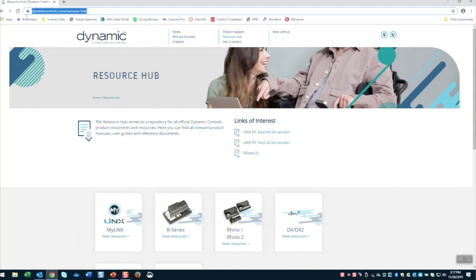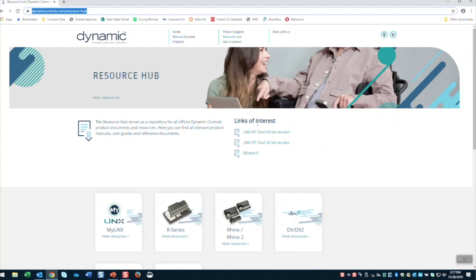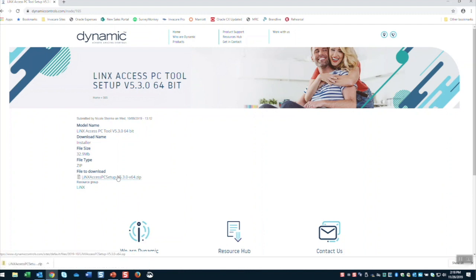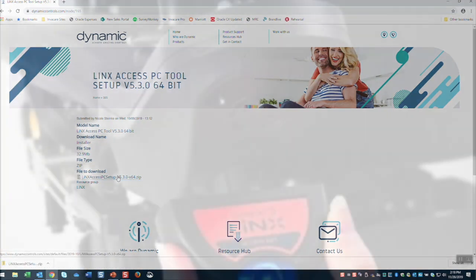Next, you will log in to the Dynamic Controls website at dynamiccontrols.com/resource-hub. In the center of the page, under Lynx of interest, click Lynx PC Tool 32 or 64-bit version, depending on which operating system you are running. Then, under File to Download, click Lynx Access PC Setup. Then, follow the installation instructions.